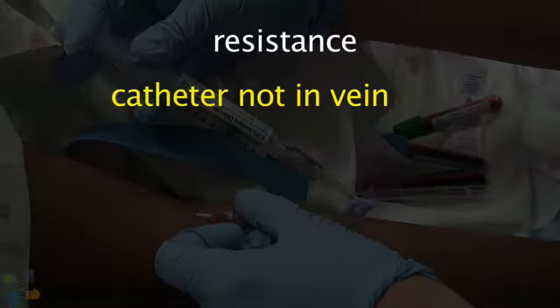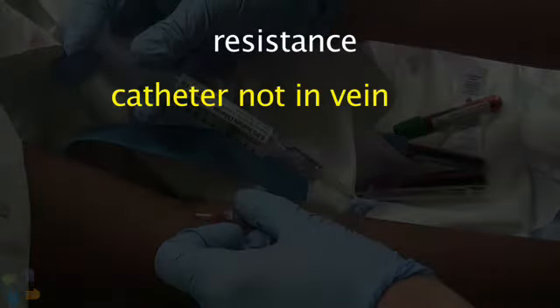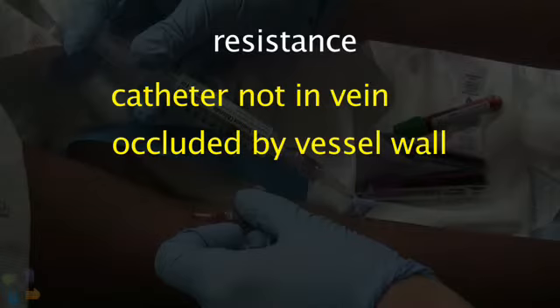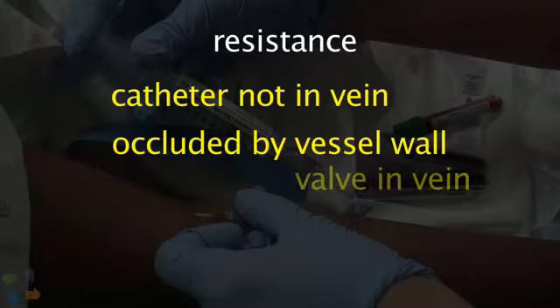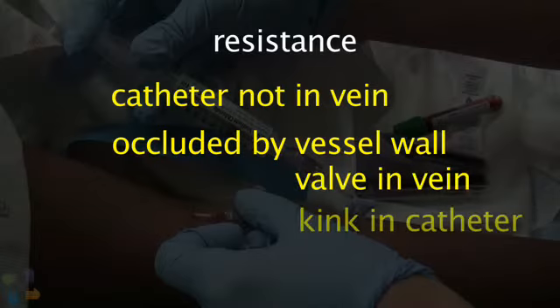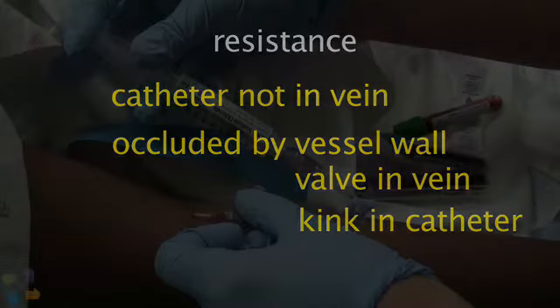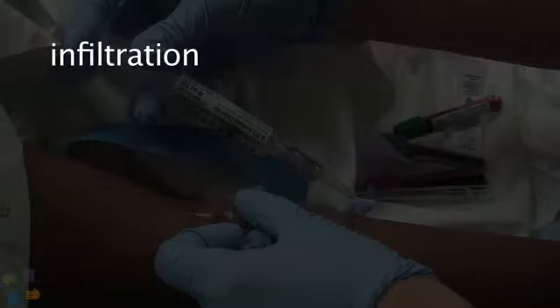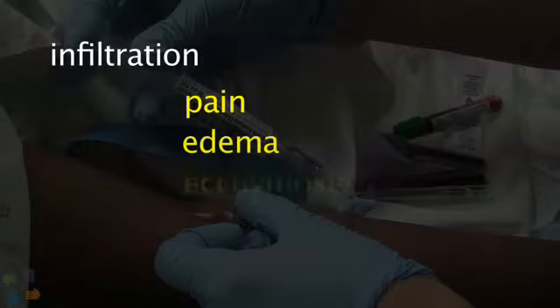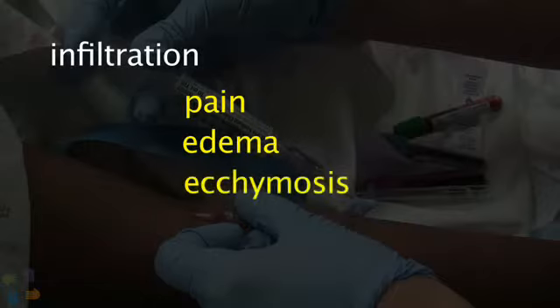If resistance is felt, the catheter may not be in the vein, or it may be occluded by the vessel wall, a valve on the vein, or a kink in the catheter. Observe for any evidence of infiltration, such as pain, edema, or ecchymosis.